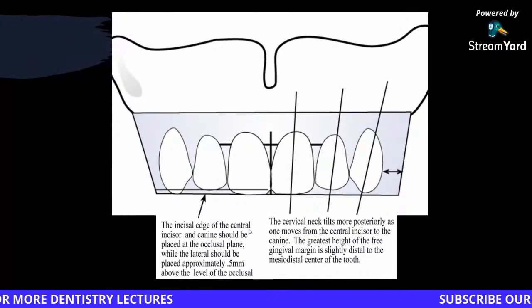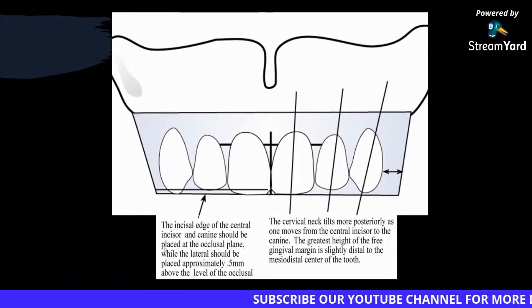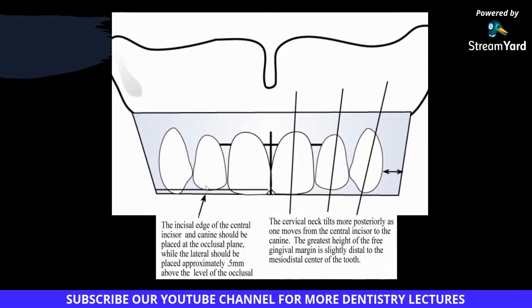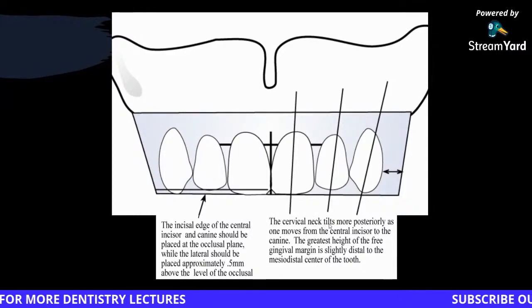The incisal edge of the central incisor and canine should be placed at the occlusal plane, while the lateral should be placed approximately 0.5 millimeter above the level of the occlusal plane. The cervical neck tilts more.